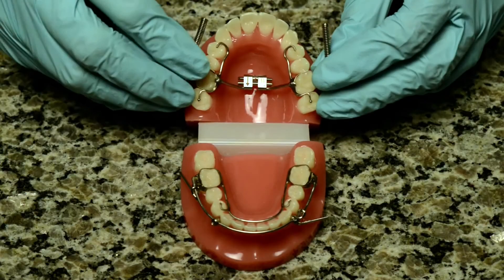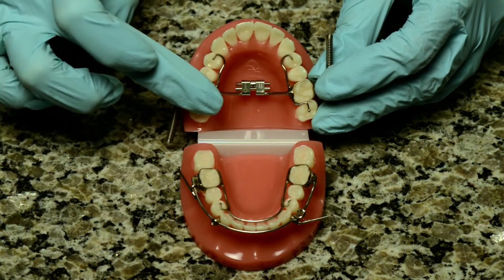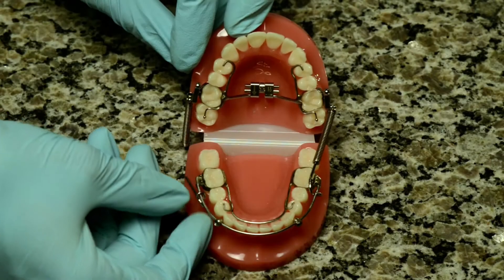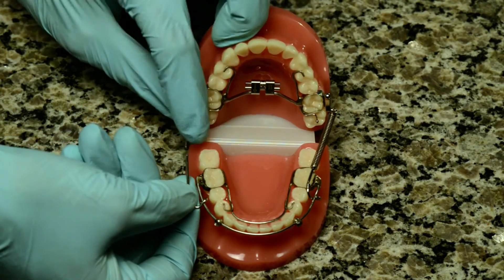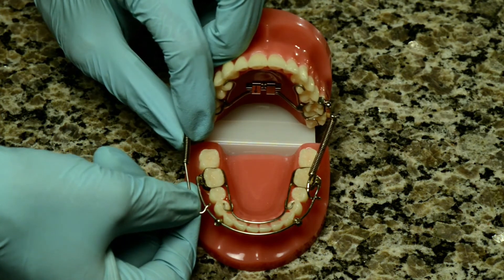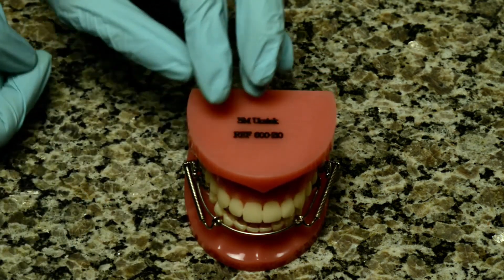Care should be taken while wearing the appliance to minimize potential problems. Opening too wide, for example, can cause the push rods to come away from the spring. If this happens, it is possible to reinsert the push rod into the spring yourself. Simply open very wide, grab the spring with two fingers and then grab the push rod with two fingers. Compress the spring and insert the rod into the spring.